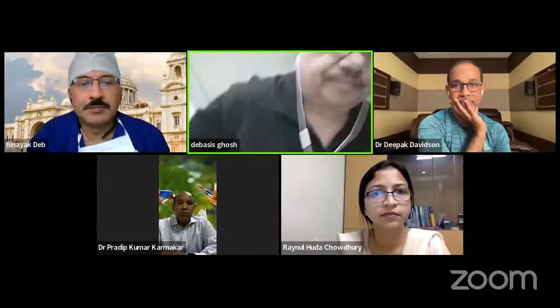Okay. Dr. Ghosh, your comments, and then we'll go to Dr. Davidson. Let's take the first case, and I do think that you should investigate her for aortic issues. But again, you had to do the lesion. Keeping it simple and a provisional strategy is fine. I always find that in a left main stem intervention, the challenge is the LCX ostium. That is my reading always. The LCX ostium is actually the main issue, which gives us bad or good results.